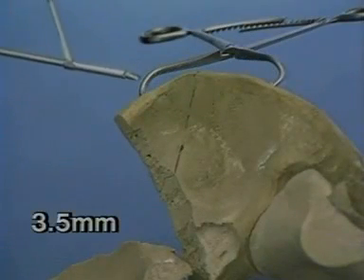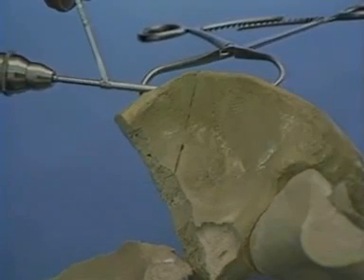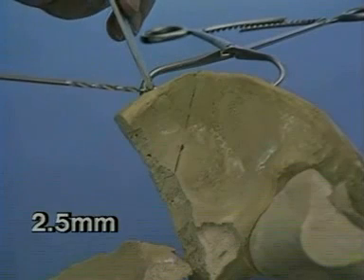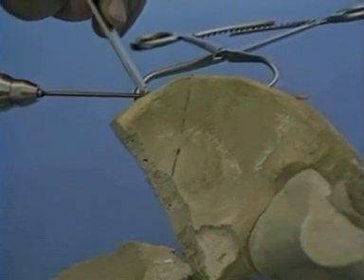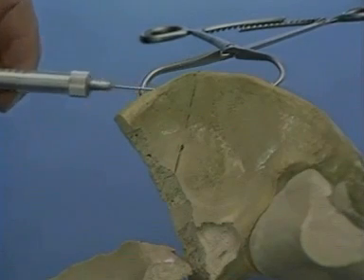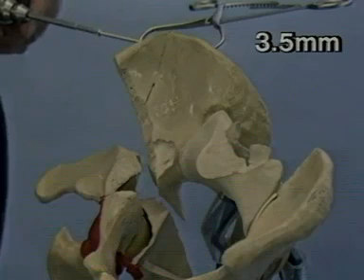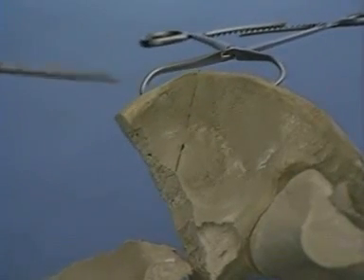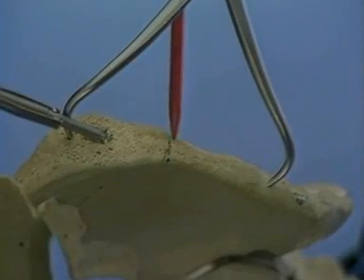Fixation is performed with a 3.5 mm lag screw placed between the two tables of the ilium parallel to the iliac crest. A 3.5 mm drill bit drills the proximal gliding hole. A 2.5 mm drill is used for the threaded hole in the intact ilium. The depth is measured, the screw is inserted, and it crosses the fracture line and exits the crest of the ilium.